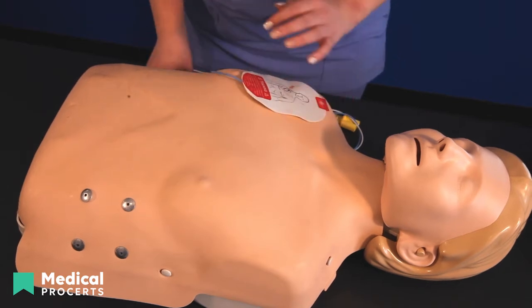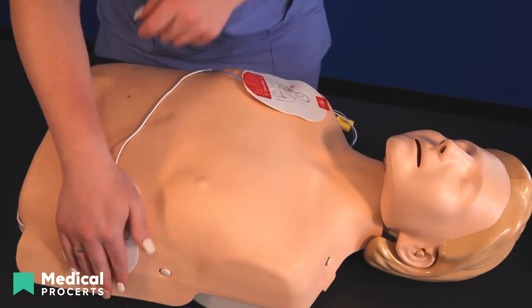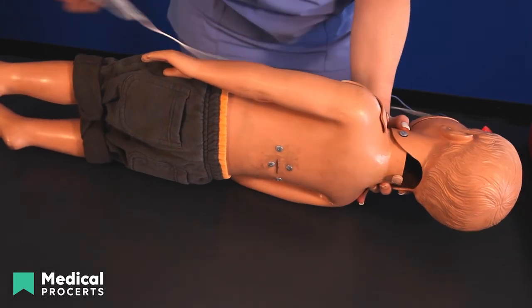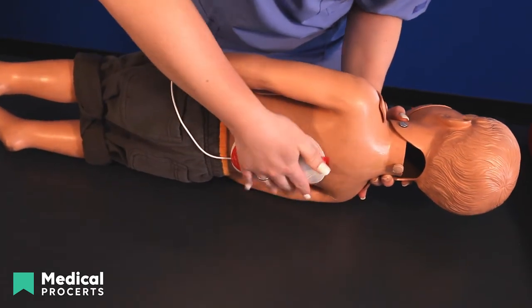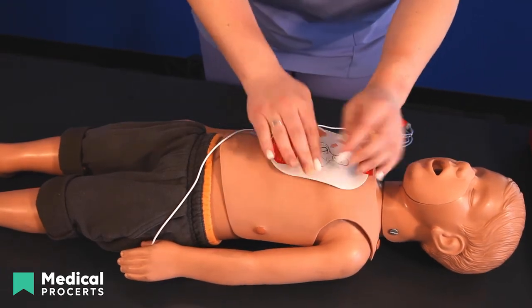For adults and children 8 years and over, use the adult pads. Place one on the upper right side of the chest above the breast and the other a few inches below the left armpit. For infants and children under 55 pounds, place one pediatric pad centered on the chest and one pad centered on the back.